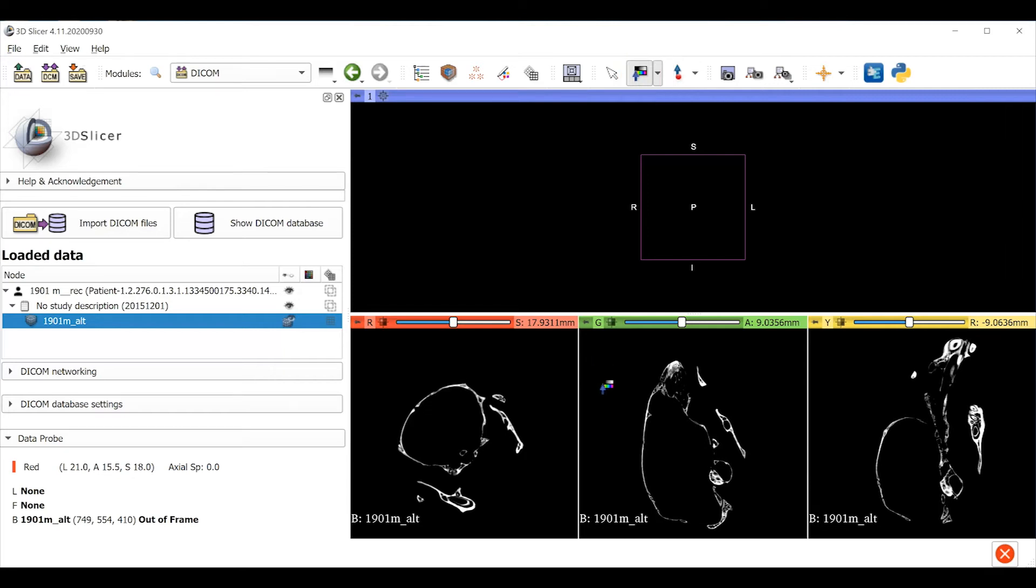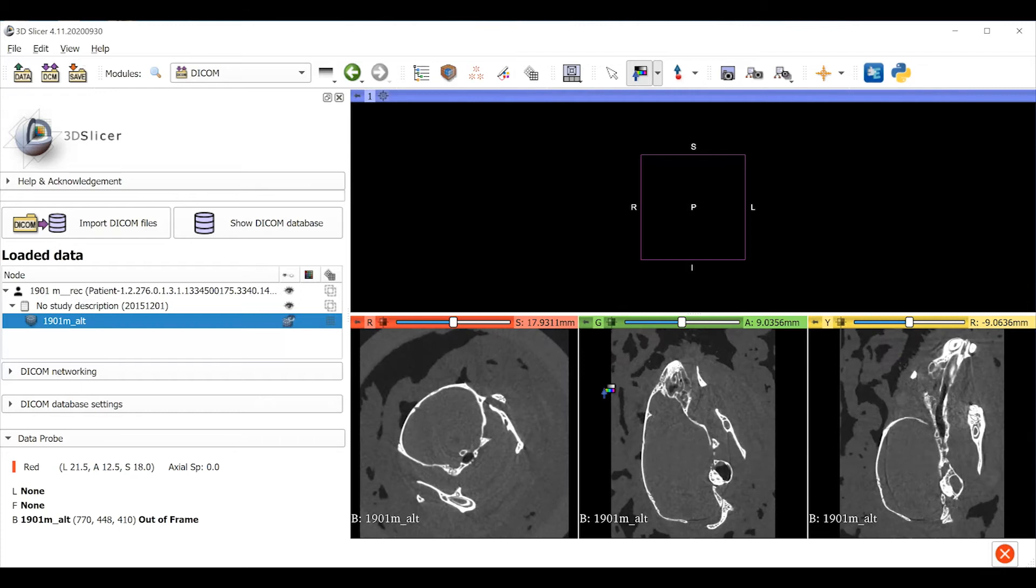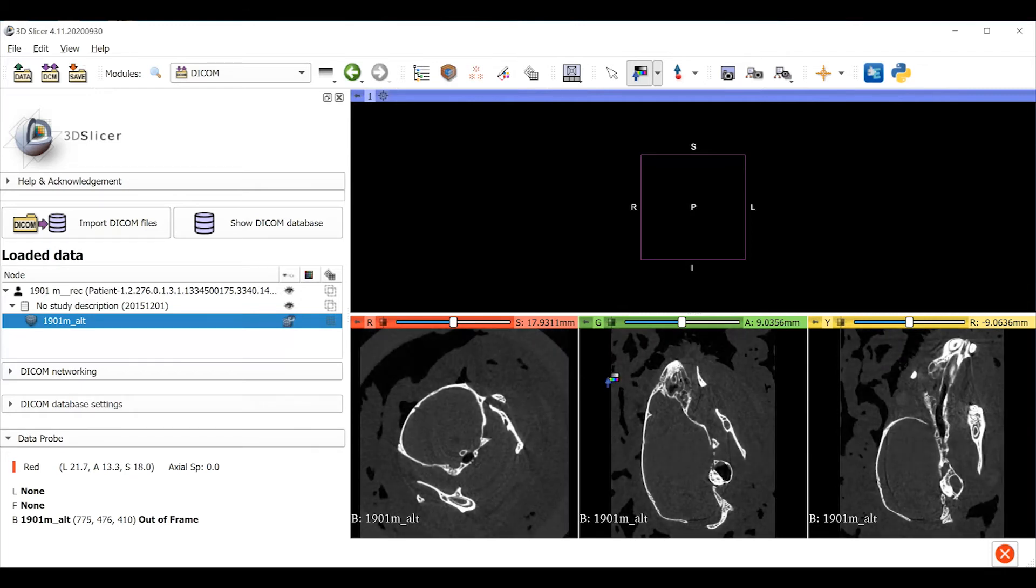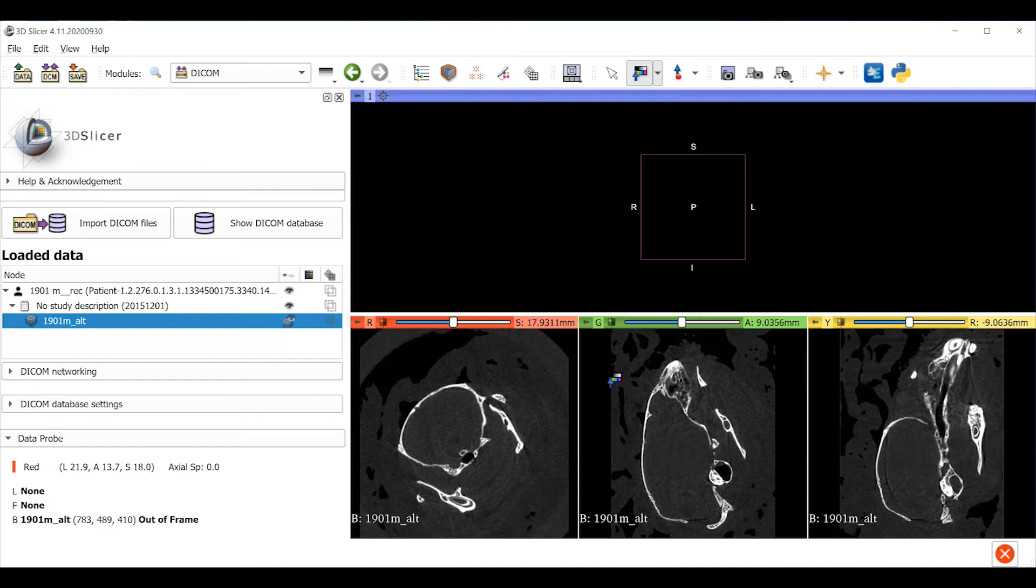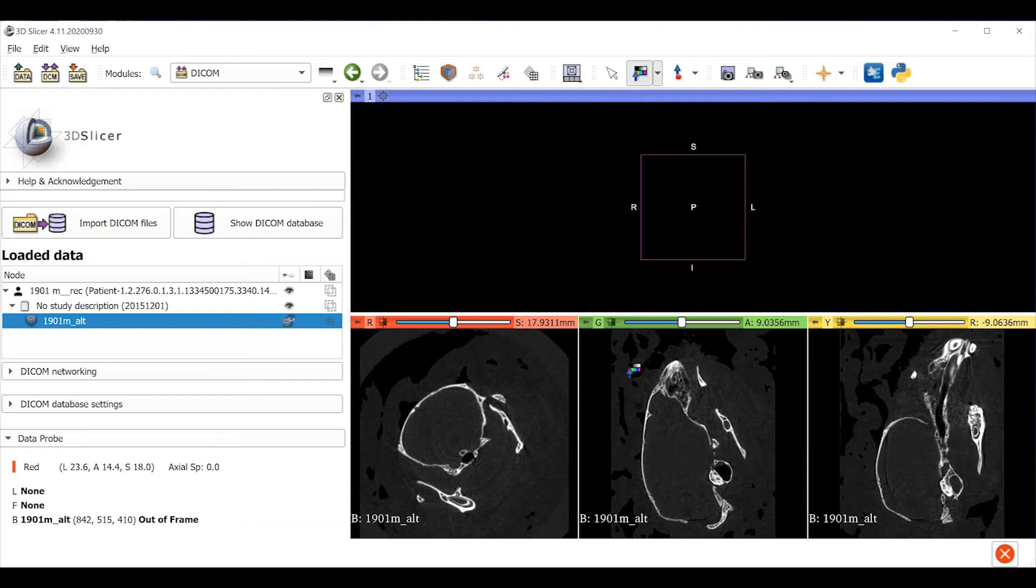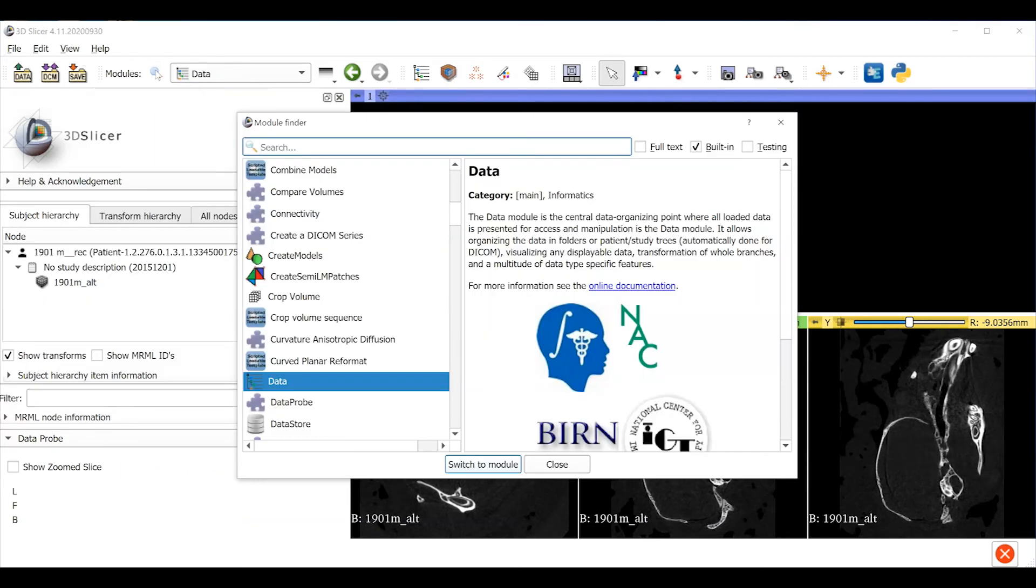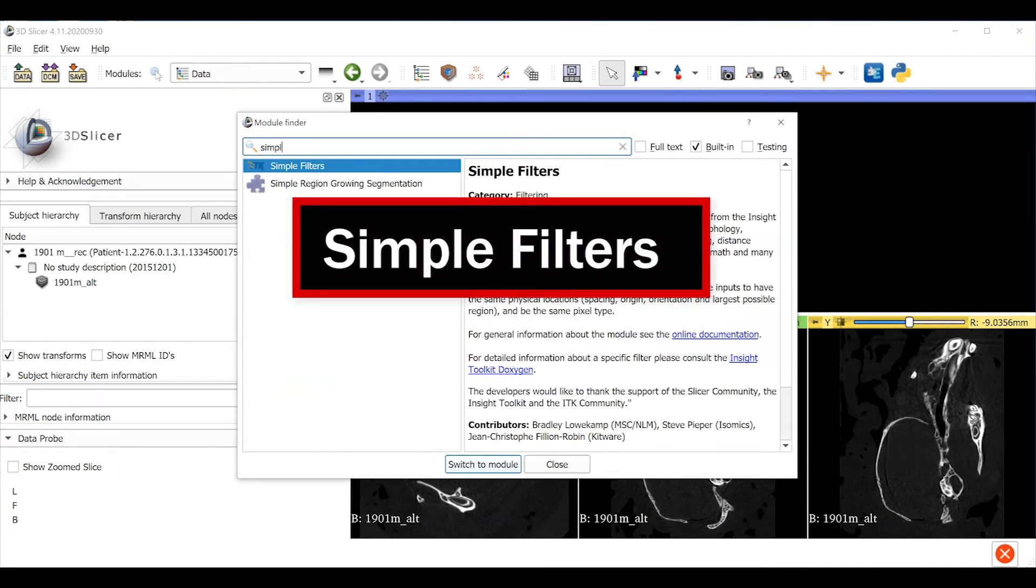Now we're going to be creating a new object here. These image data can get really large and bog down our computers. So we want to do whatever we can to keep the file size as small as possible while still maintaining the required quality of the image data. One way we do this is to convert that data to 8-bit format. It requires two steps. Use the magnifying glass icon to search for the simple filters module.